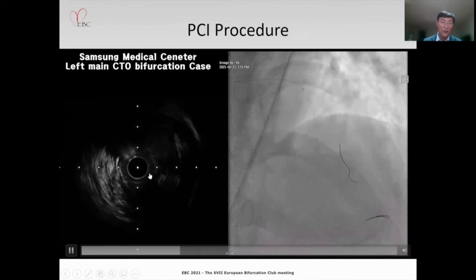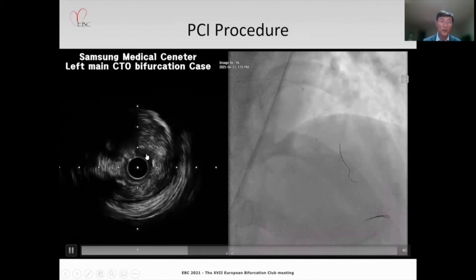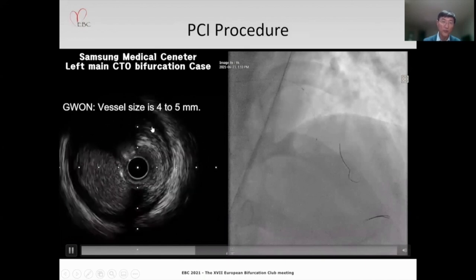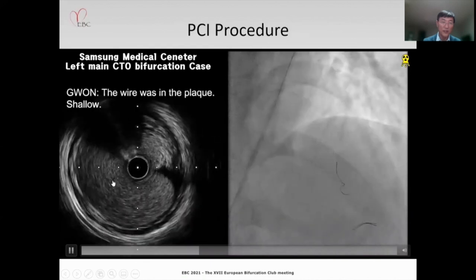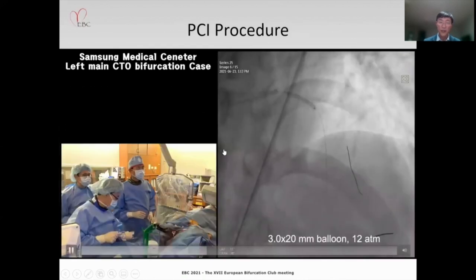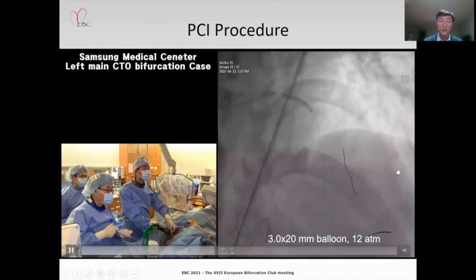So the wire is traveling almost through the bifurcation. This size is more than 4, almost 5, and this is the left main and through the bifurcation. So we did a 3.0 balloon at 12 atmospheres.